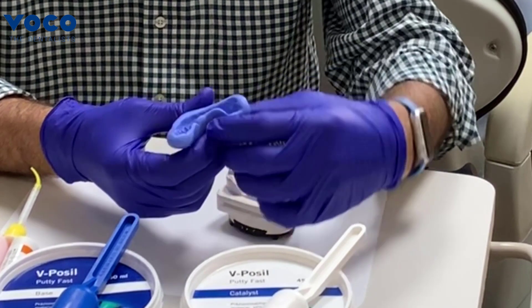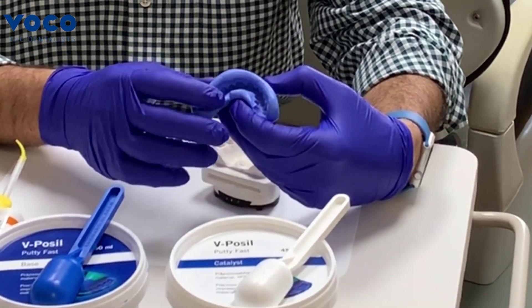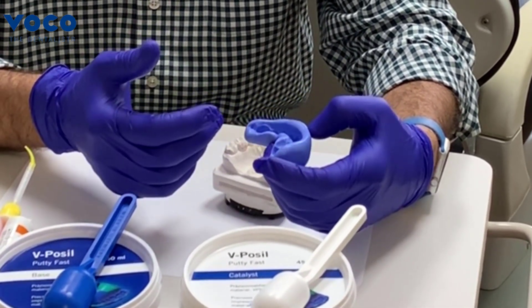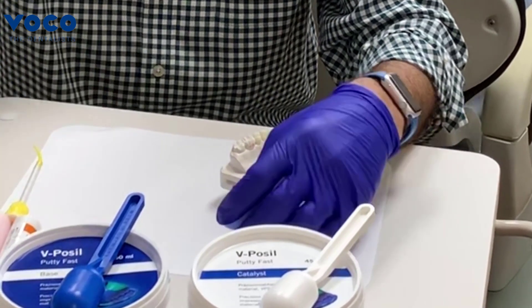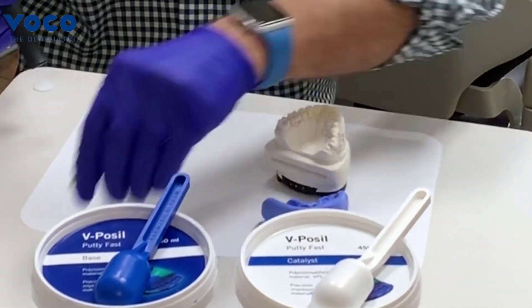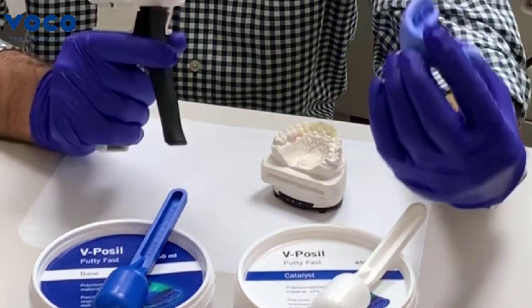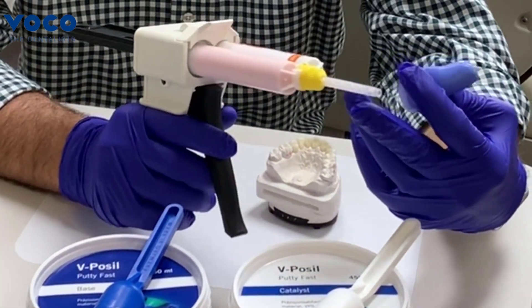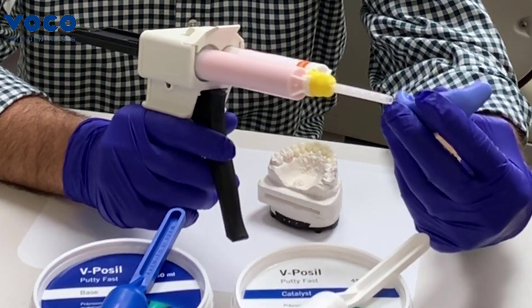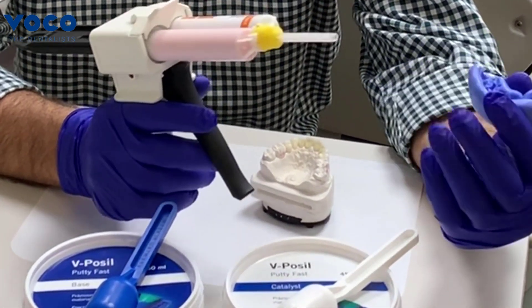At this point you'll want to make sure that you're tightly adapted to your wax-up, but even if you are, I think the next step is crucial in order to get a form-fitting temporary, and that is to utilize a light body impression material. Make sure that if you used a VPS putty you use a VPS light body impression material and that they're compatible. I always recommend staying within manufacturer's lines when doing this.